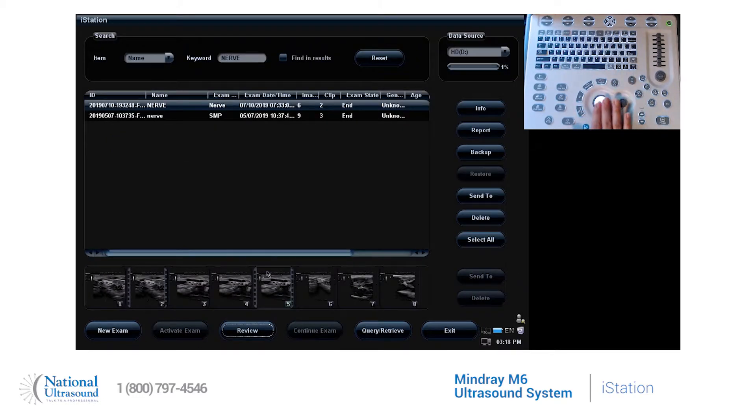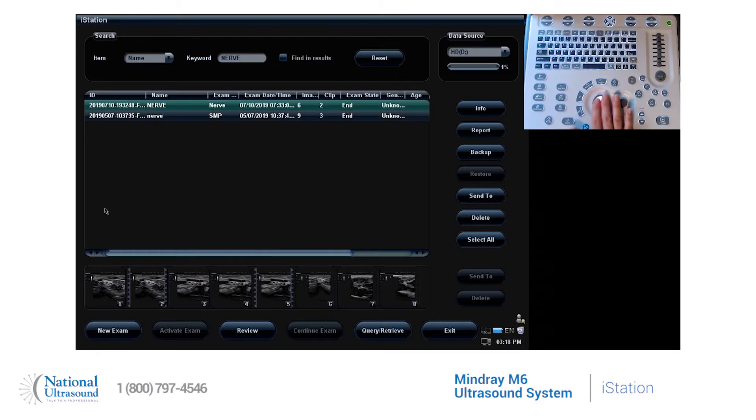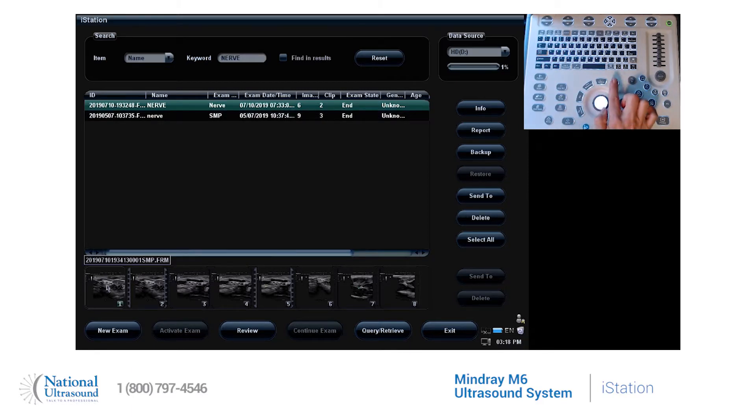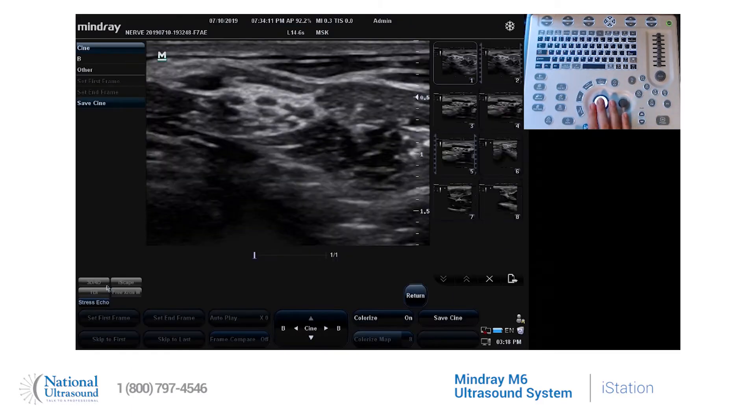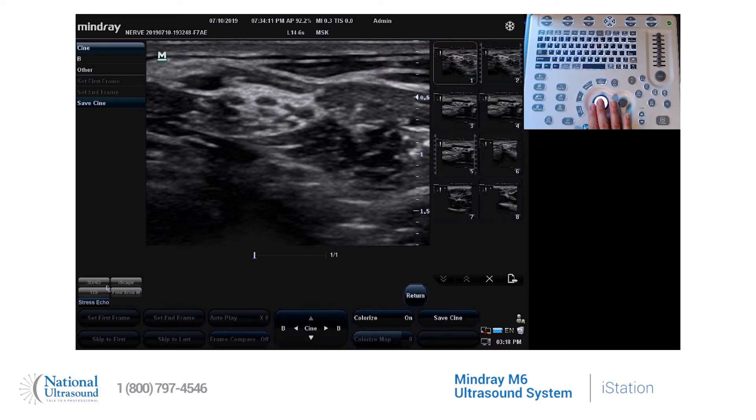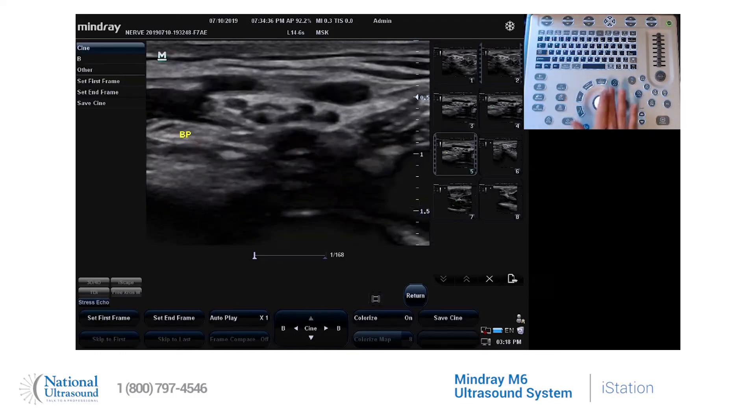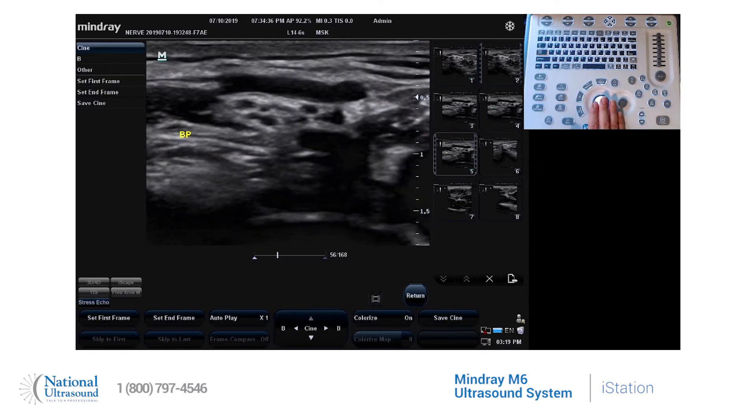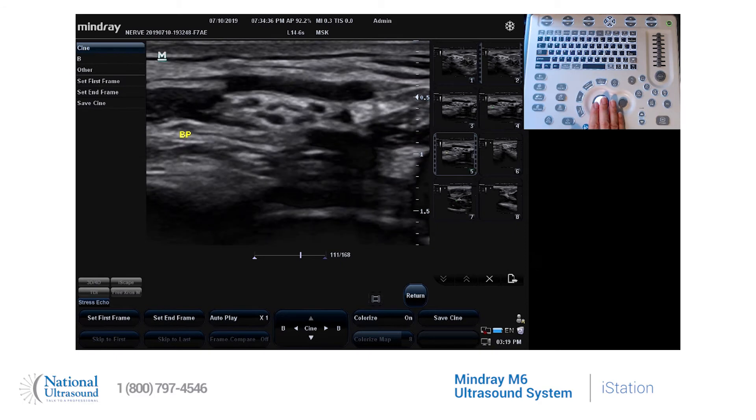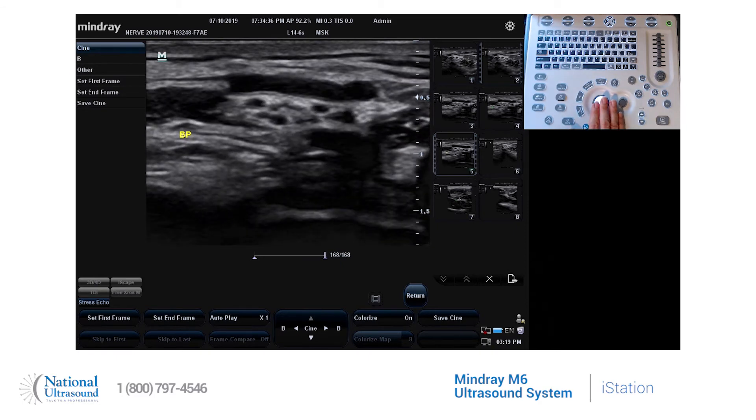You are going to go back into iStation. Once you highlight the study and the images are below, you can also double-click on any one of the images to bring the study back up on the screen like you were scanning live. Then use the cursor button to scroll to any of the images and double-click on it and it will bring the image up on your screen.